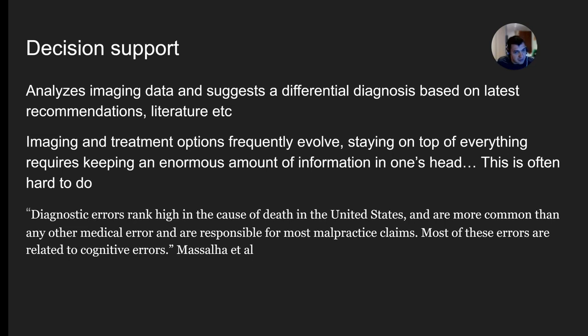And that, in essence, is decision support, where you come in, you open your patient, whether you open it in imaging or whether you're a physician just opening up your electronic medical record, and having a virtual assistant that can say, I've analyzed all the information that we have about this patient. This is what I've come up with. Those are the ideas that I can suggest to you, and then you ultimately can make the final decision as the most responsible physician.